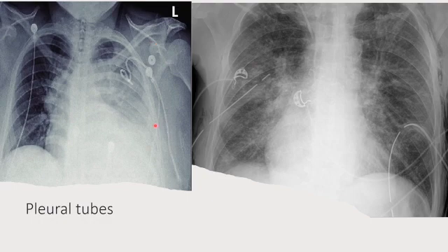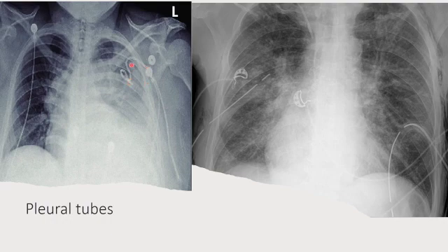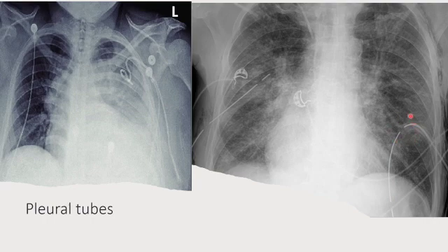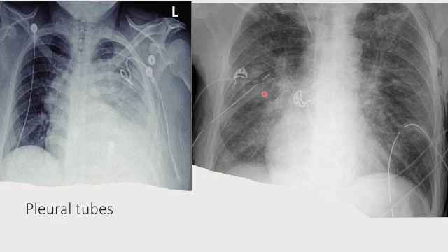These two images show a pleural pigtail drain and surgical chest tubes. Pleural pigtail drains are typically placed by interventional radiology or the pulmonary team for pneumothorax or simple pleural effusion. These have multiple side holes, and you want all side holes to be within the thoracic cavity. Surgical chest tubes also have a break on the radiopaque marker at the last side hole, which must be within the thoracic cavity. If the second break is outside the thoracic cavity, the tube is too far out and needs to be repositioned.